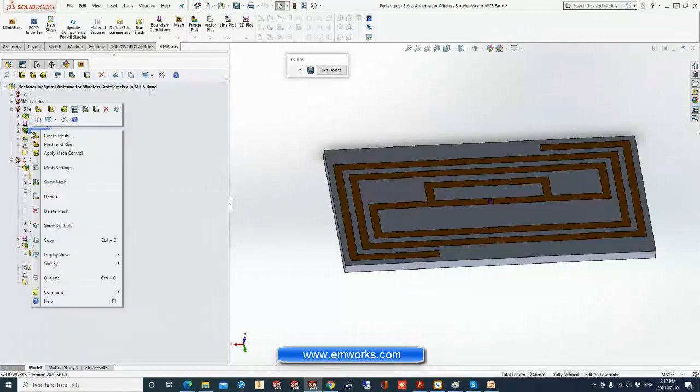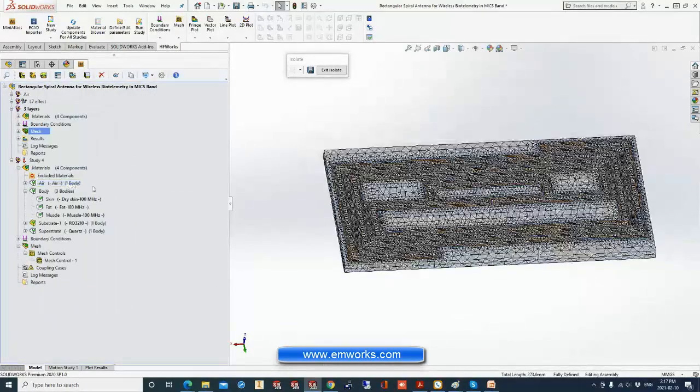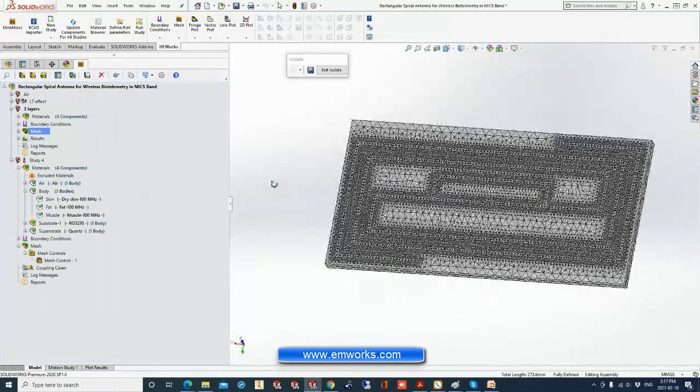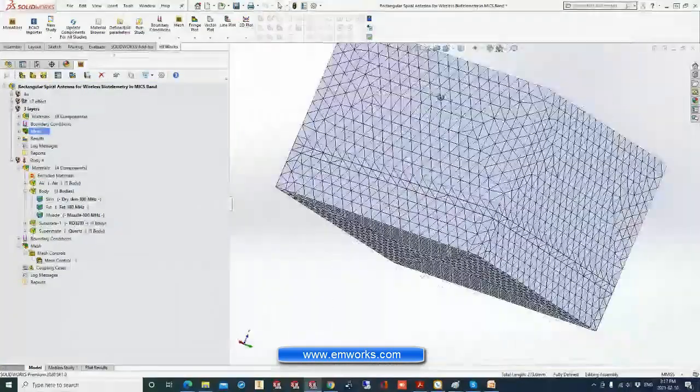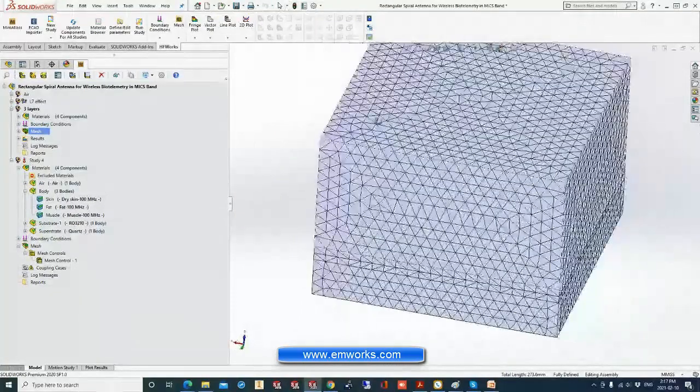So let me just now show you the mesh. This is the mesh, the substrate. Everything is meshed, but we can hide or show any part.